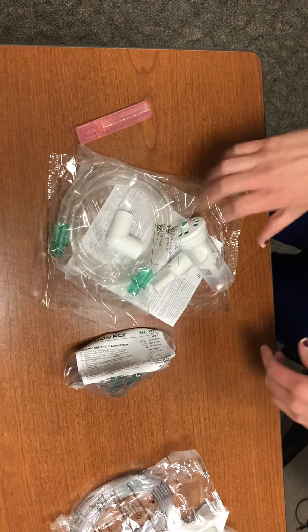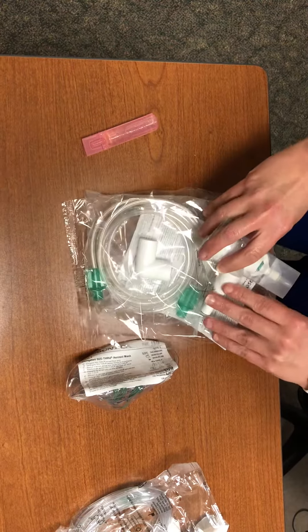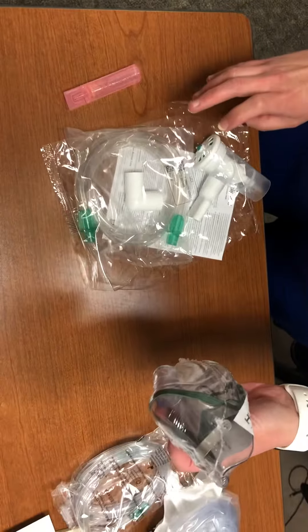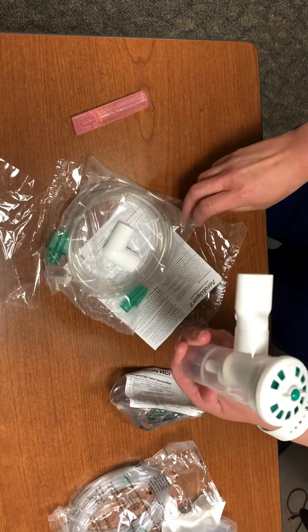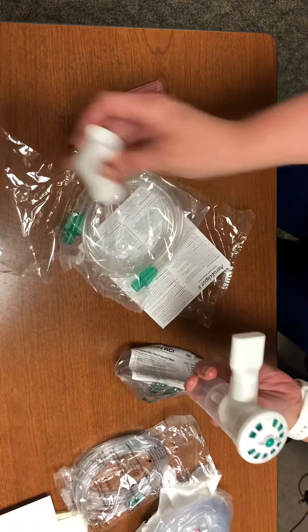First we're going to start with a nebulizer set up to give a breathing treatment in the ER. You'll have this package here, which is an all-in-one contained piece, and then you'll have the mask depending on what you're going to do. First we'll talk about a mouthpiece treatment — you're going to open it up and you'll need this piece here. This piece you will not need until you're going to do a mask treatment.